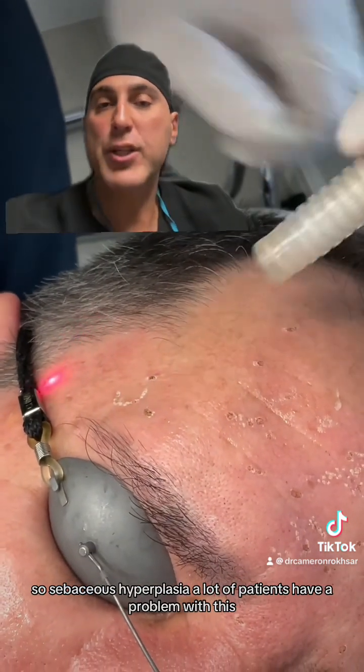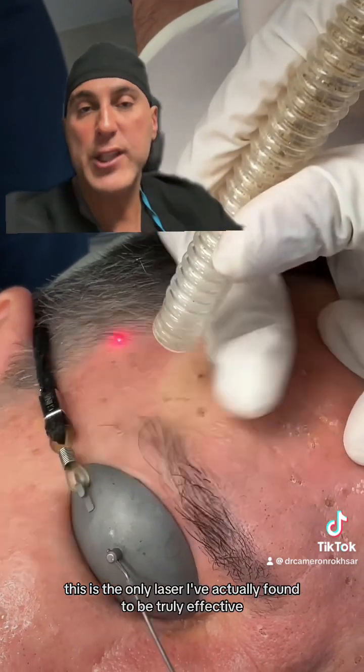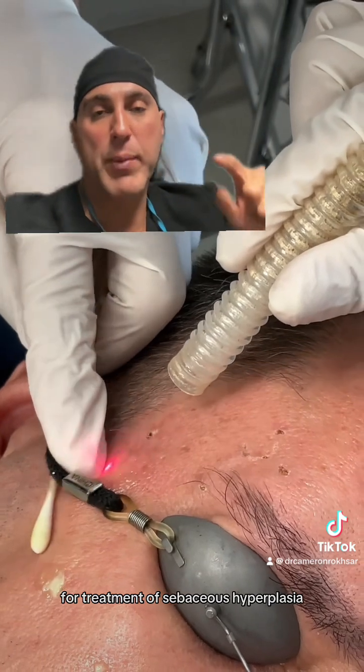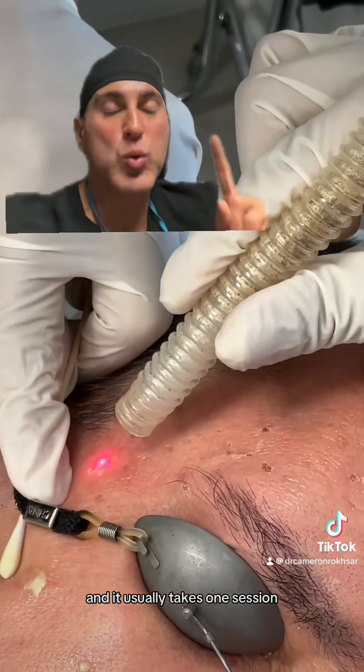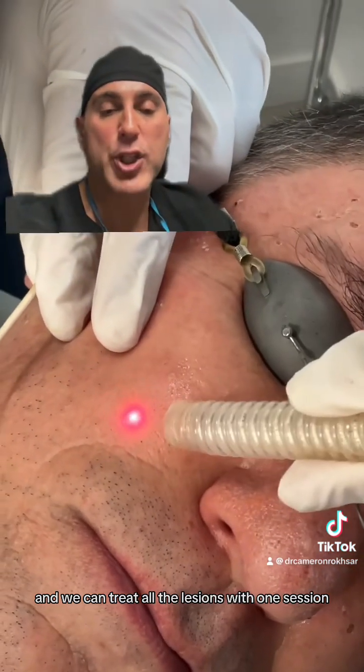Sebaceous hyperplasia — a lot of patients have a problem with this and don't know what to do with it. This is the only laser I've actually found to be truly effective for treatment of sebaceous hyperplasia, and it usually takes one session to treat all the lesions.